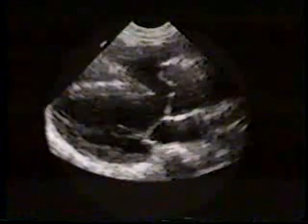Note here right ventricular hypertrophy, large subarterial ventricular septal defect with a dilated overriding aorta. The left ventricular size appears normal. This is the parasternal long axis view of a patient with tetralogy of Fallot.